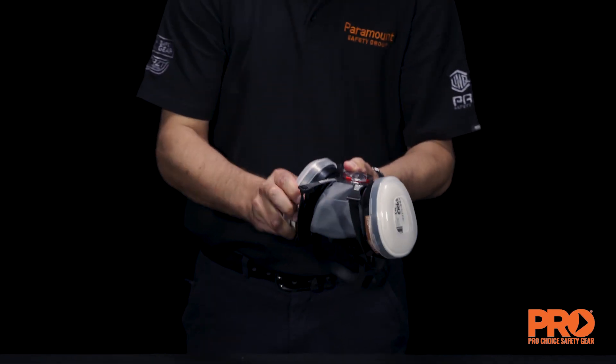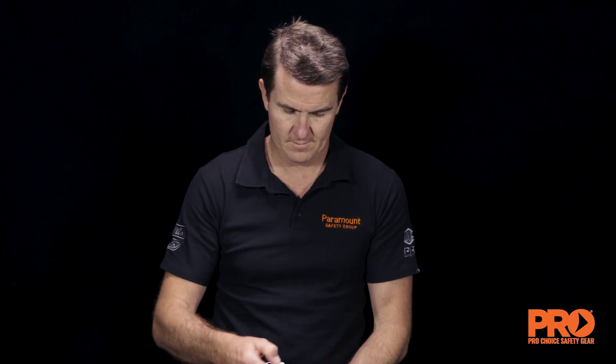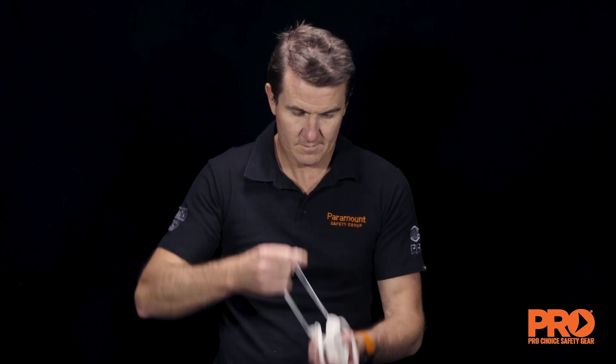Prepare the respiratory mask to be tested. Don the mask and ensure it is comfortable. Then conduct a negative or positive pressure fit check to ensure an adequate seal.